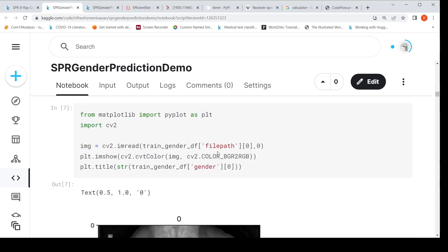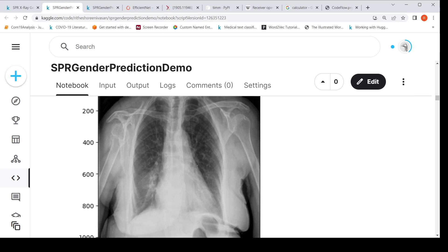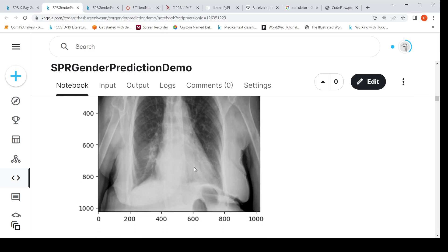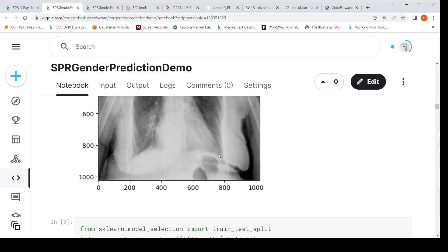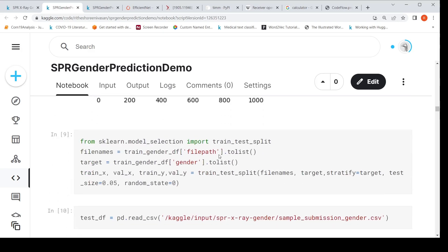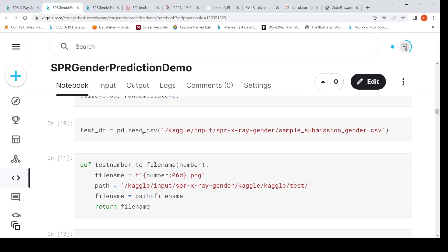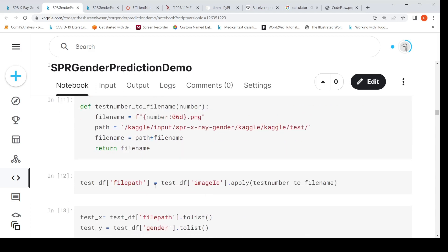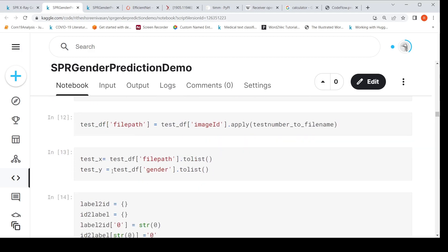You can visualize one of these images by passing the file path to cv2.imread, show the gender label, and plot it. This is the first image — a female patient. I also read the test data from sample_submission_gender.csv, convert the image IDs into file paths, and get test_X as the list of file paths and test_Y as the corresponding dummy gender values.